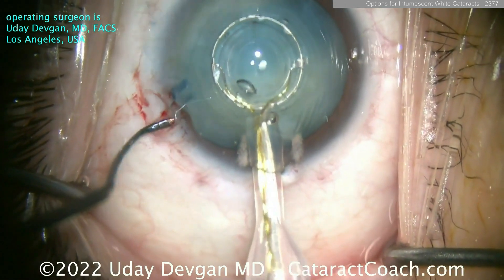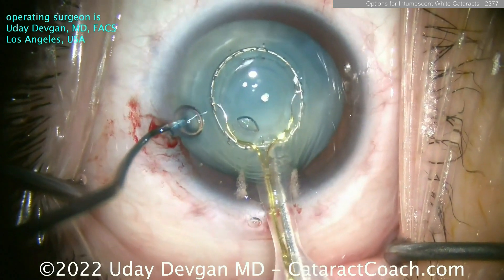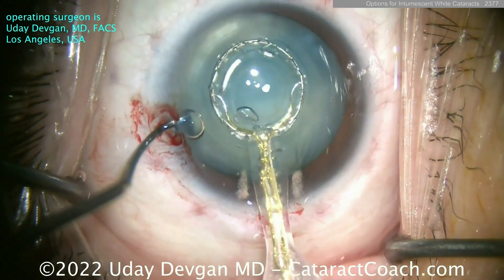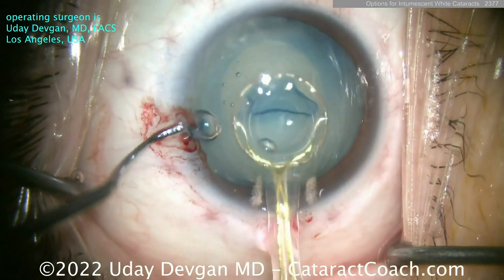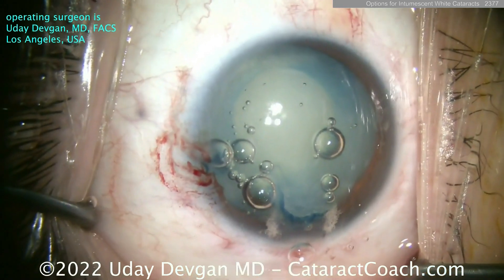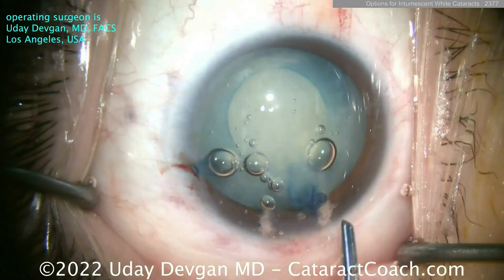Aspirate and put a little suction pressure there — it holds this ring onto the lens capsule. Once you achieve that suction, in four milliseconds — boom — there's a little burst of energy, and that creates a beautifully round capsulotomy. At this point the rest of the case is pretty easy. There's the capsule.